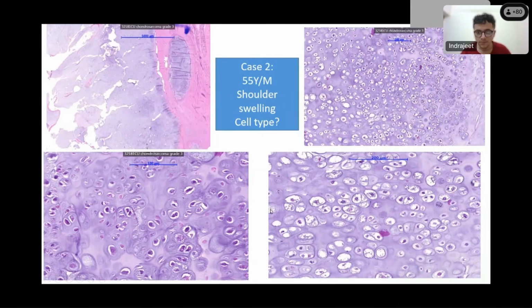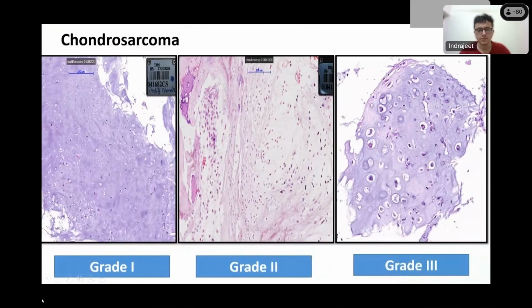And remember, in chondrogenic tumors, you will never find an atypia in the league of osteosarcoma. And that becomes our struggle when we encounter the chondroid lesions, because the moment you start seeing so much atypia, this is straight away a grade 3 chondrosarcoma. You don't have to worry about it, but anything which is less than that, you have to struggle because it still can be a chondrosarcoma. Like here, believe me, this is a grade 1 chondrosarcoma which showed permeation into the bone.